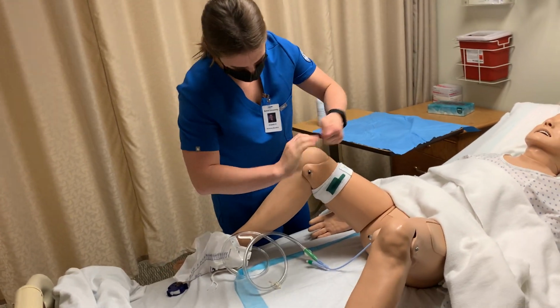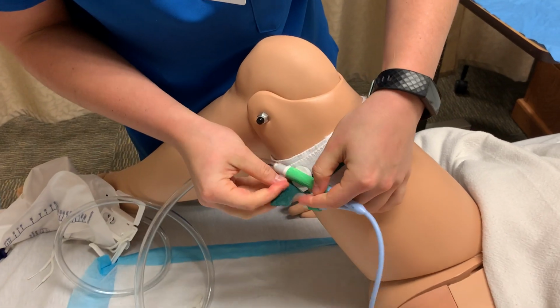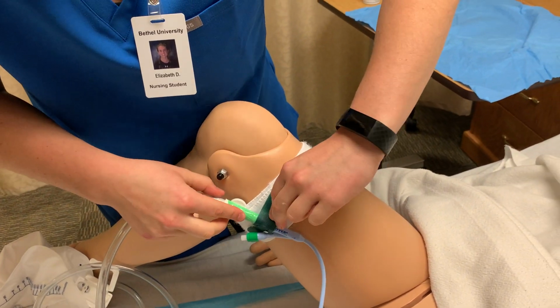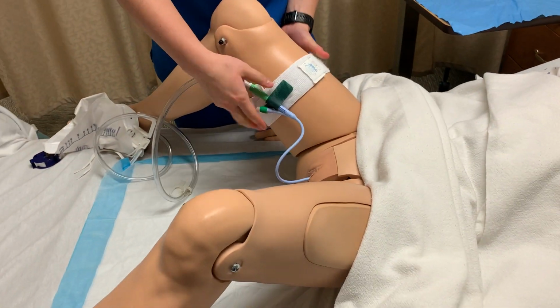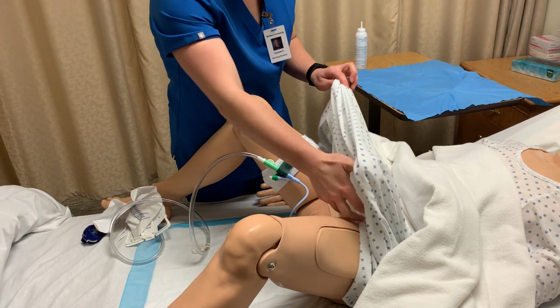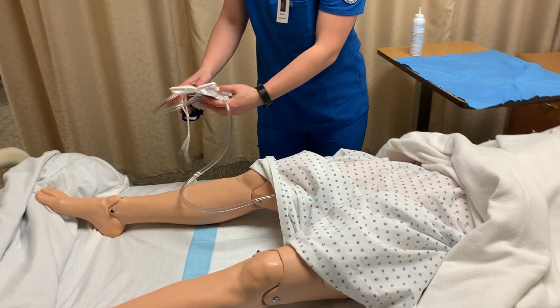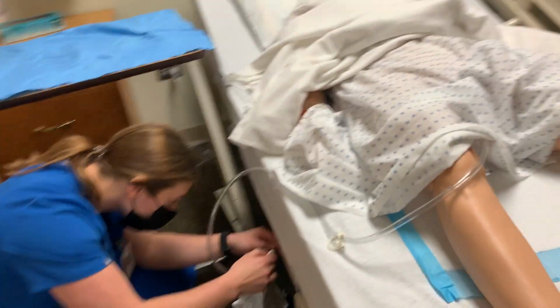We're going to go ahead and attach this tubing to the leg. Okay, and we want to make sure we left plenty of slack here so the patient's free to move as they need to. Okay, we're going to go ahead and cover you back up. You can put your legs back down. And then we're going to go ahead and secure this to the side of the bed on a non-movable part.